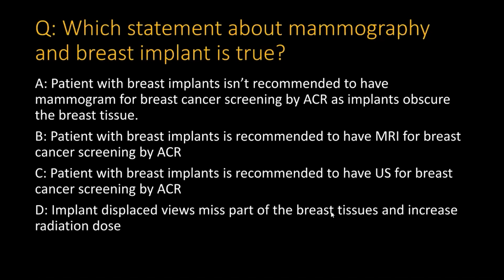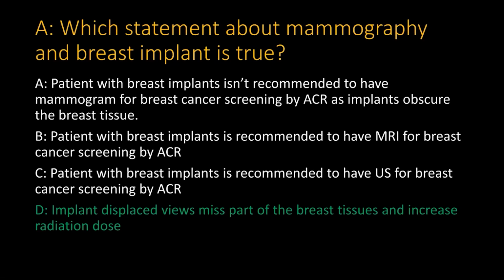Let's start with the question: which statement about mammography and the breast implant is true? All right, let's see the answer over here. Most of you chose number D. Let's review it together. The correct answer is D. Implant displaced views miss part of the breast tissue and increase radiation dose. So ACR still recommends mammogram with implant displaced views for screening.